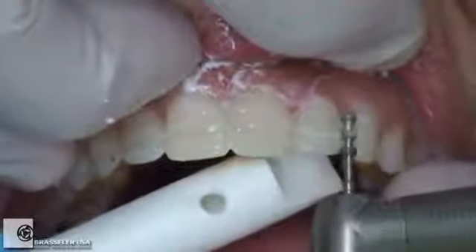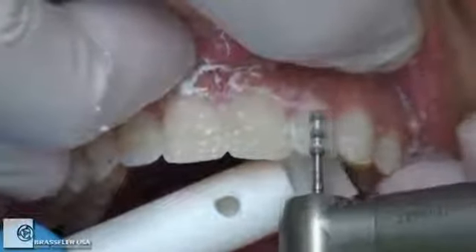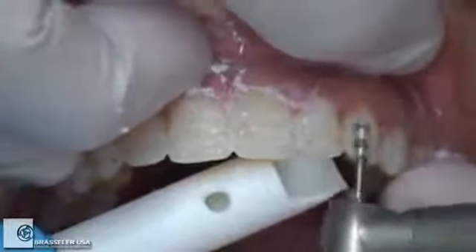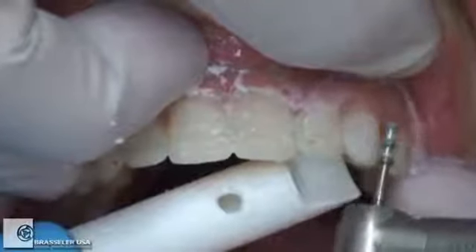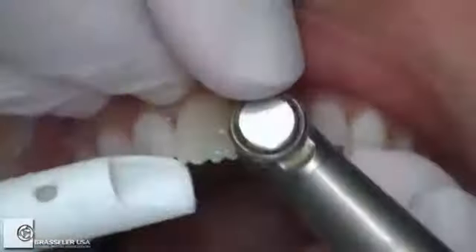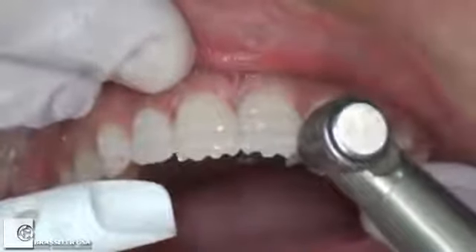It's an LVS1. And you can see me pass along, and the middle third and the incisal third, I'm really not cutting the gingival third. I'm being very careful that I don't cut the papillas. If you're passing from one tooth to the next, it can be easy to dig into the papilla a little bit, so I'm very careful about that. So I'm really only using the middle and incisal third. I might go back and pass a little bit in the gingival third, but I'm going to end up tapering the veneer down to the gingival margin.